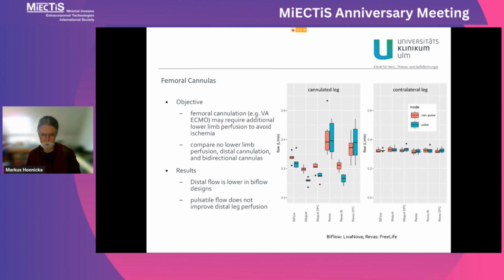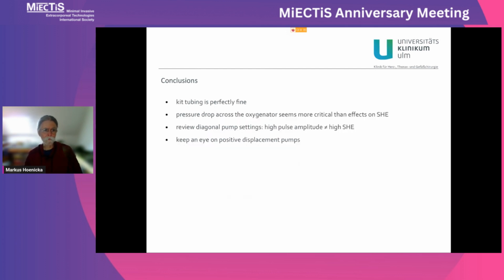A couple of cannulas, the Rivas, and with or without an additional cannula were actually best and were not affected by pulsation. So let me summarize this real quick.